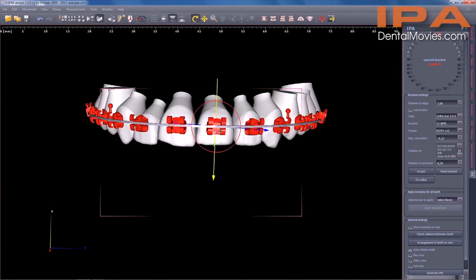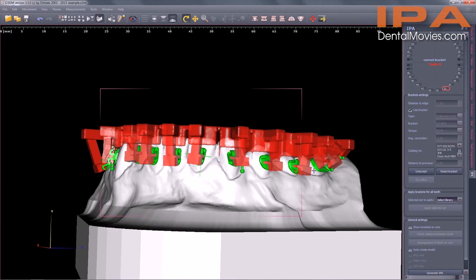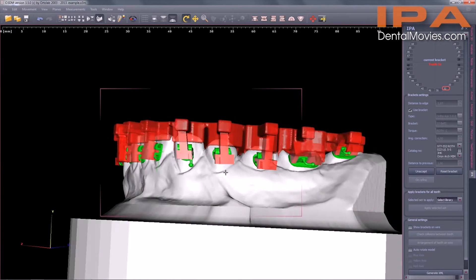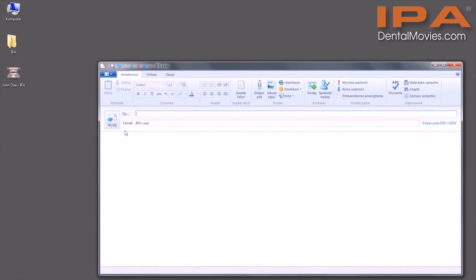Equally as important as the planning is the execution of the treatment plan. The IPA system offers ultimate precision thanks to its position-in jigs for indirect bracket bonding. The jigs are fabricated on the basis of the positions of the brackets planned by the dentists. A file with the final data including the model and bracket positions must be transferred to the laboratory for the purposes of fabricating the IPA kit.